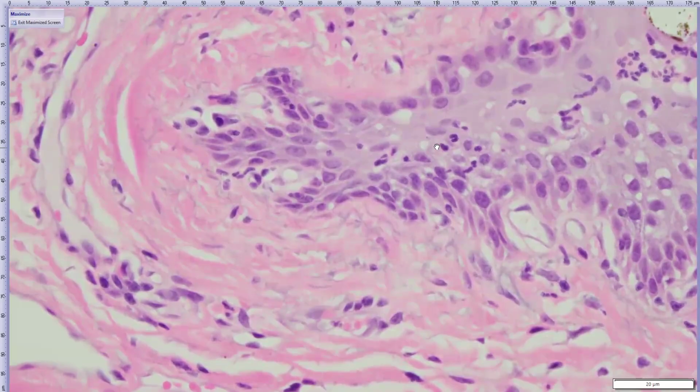However, it's worth noting that we do occasionally get cases of hemangioma or hemangiosarcoma that are essentially confined to the cornea in our sections, which is weird because the corneal stroma is a relatively avascular structure. So there shouldn't be a lot of vascular endothelial cells there to begin with to become neoplastic. It's worth mentioning, even though it may not necessarily apply to this specific individual, that if you see a corneal hemangioma or hemangiosarcoma, it typically implies that there was some sort of vascularizing condition in the cornea to begin with that then eventually became neoplasia. So probably the cornea wasn't right even before the tumor started. And that's all that I wanted to talk about for this case.